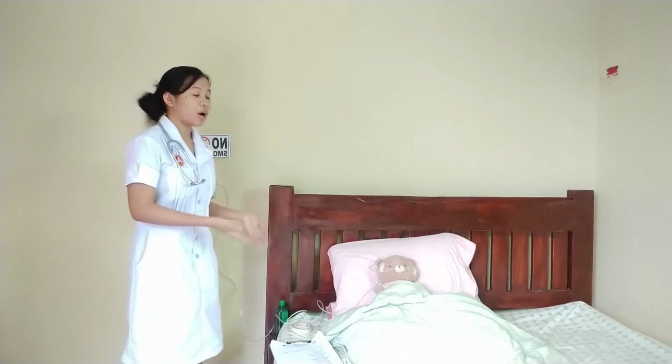Also, we should report the findings that deviate from normal to the primary care provider, and we should always ensure that the patient is comfortable. So that's all for the oxygen administration. Thank you.